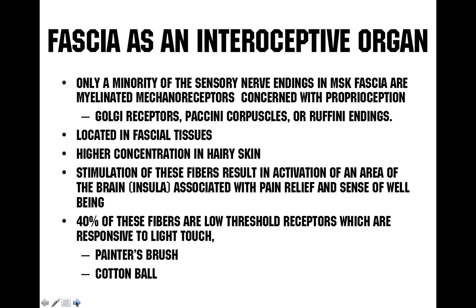Some OTs out there use very soft nail brushes to actually cause some inflammation in the skin to mitigate pain, believe it or not. And we take our tools and use an edge at roughly 30 degrees, and we go extremely fast and very, very light. We'll do some pre-test, post-test to see if we actually mitigate pain.